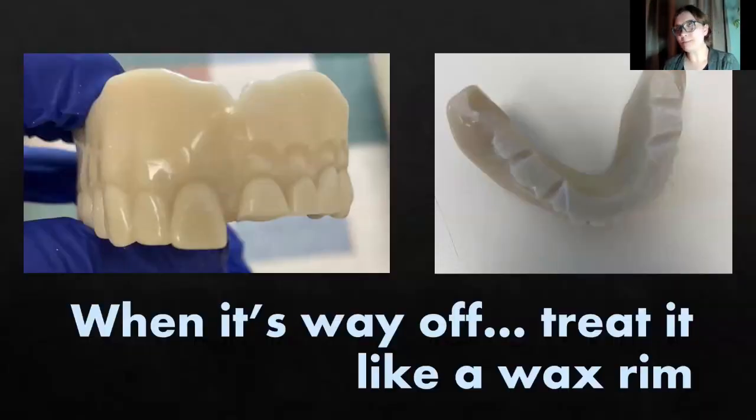And I think one of the biggest hurdles to overcome, and this is the biggest problem that I've had when I'm training new dentists in this workflow, is that the monolithic try-ins are made for you to modify. So if you think about it more like you're doing a trial smile for veneers or crowns or implant fixed prosthetics, we're usually not afraid to adjust those to protect our implants or to finalize our occlusion or to improve the aesthetics. But for some reason, I think we have this hesitancy to grind on these dentures because they look like the final denture. And with conventional denture teeth, you don't want to grind on them like crazy, of course.